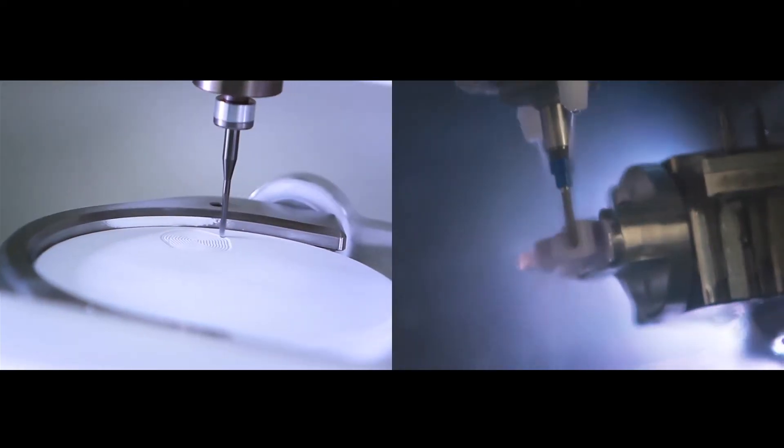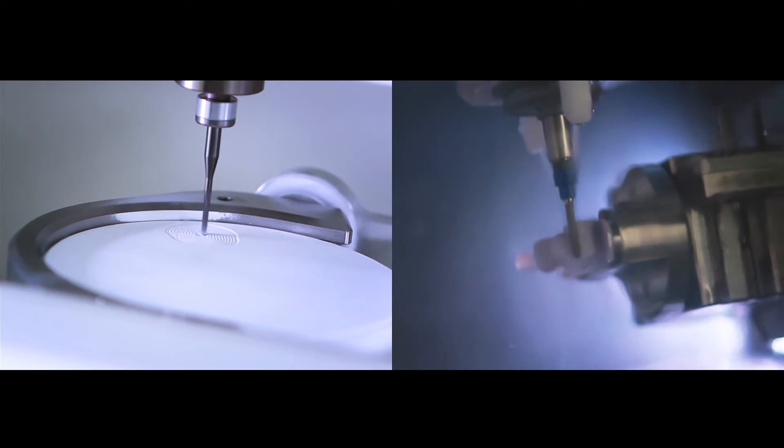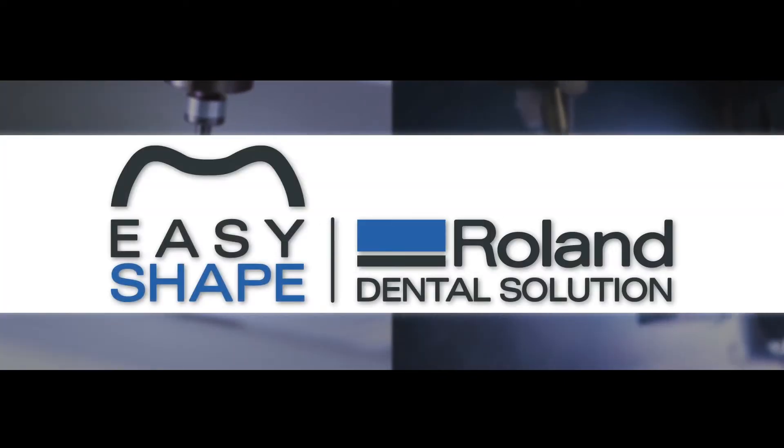Whether your dental restoration business requires standard milling or a wet milling workflow, Roland DG has the solution that's right for you with the DWX4W wet mill and DWX51D dental mill.